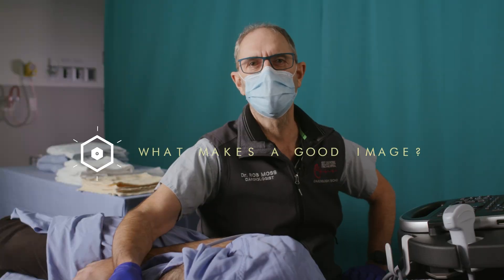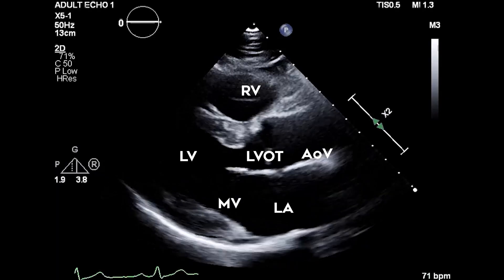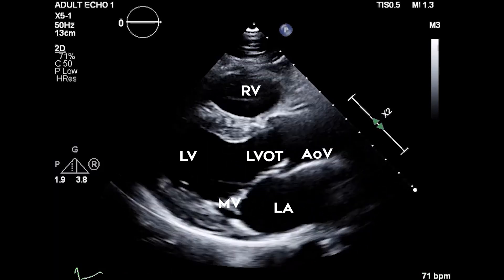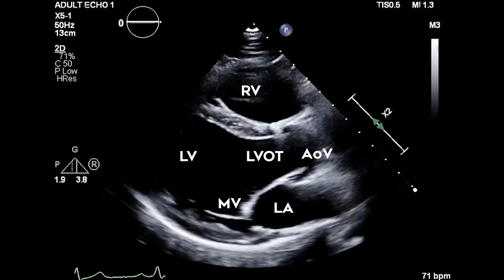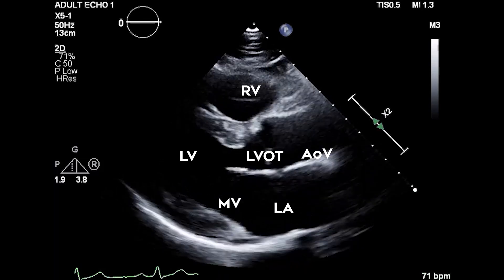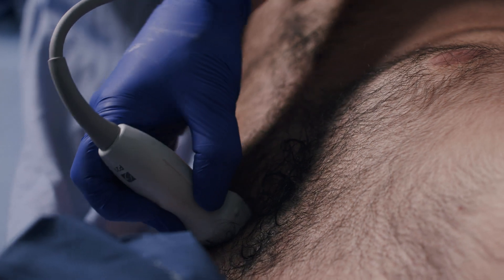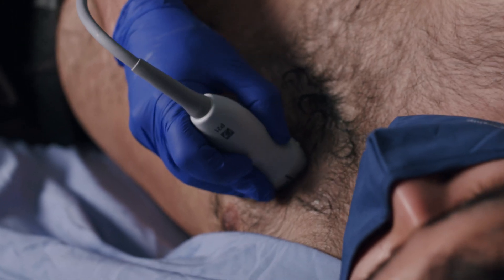How do we know when we have a good image? The ideal image should cut through the long axis of the heart and show the left ventricle contiguous with the left ventricular outflow tract. The full motion of two of the aortic cusps and both anterior and posterior mitral leaflets should be apparent. We don't usually see both papillary muscles or the cardiac apex in this view — if we do, the image probably requires adjustment, which we can correct with subtle tilting or rotational movements.